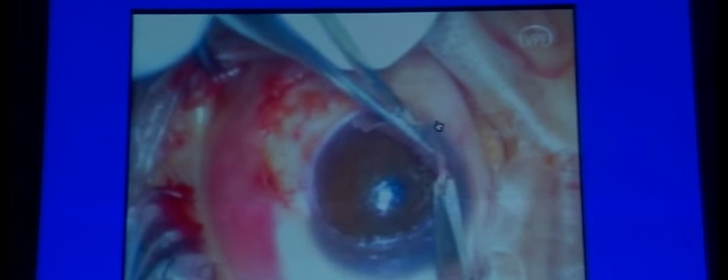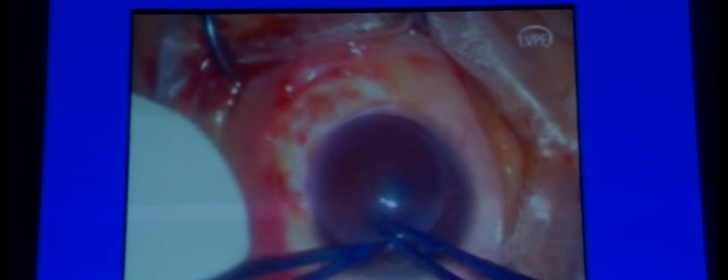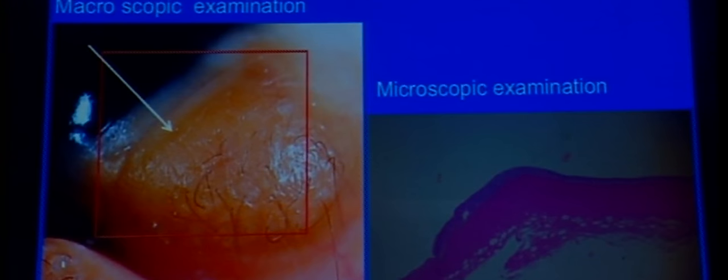It's very important to preserve at least two-thirds of the limbus. One must ensure the remaining limbus is functionally intact to maintain epithelial viability. The goal here is a uniform dissection plane of about 80% depth without much debris in the interface. On histopathology, this is a complex choristoma — at times containing salivary gland and cartilage components.